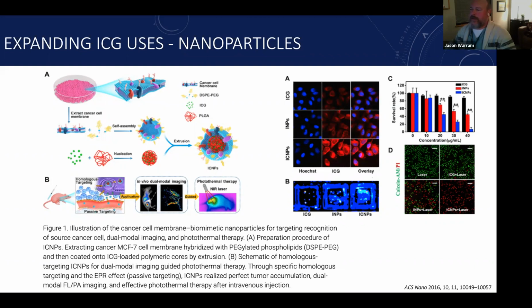This is another exciting trend that I think is going to be evident in the future: the addition of a therapeutic agent that's coupled in some way to the fluorescence targeted agent so that you get localization and therapy combined in one procedure. As those of us who have worked with these targeting fluorescence agents in real time in patients know, there's very little hope that the sub-millimeter islands of cancer cells are going to be detected using the fluorescence, particularly if they're occult lesions or skip lesions, or areas that are covered by normal tissue.